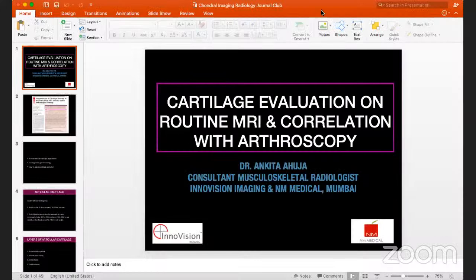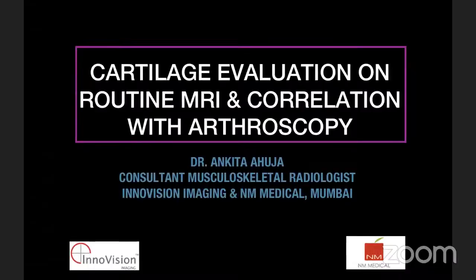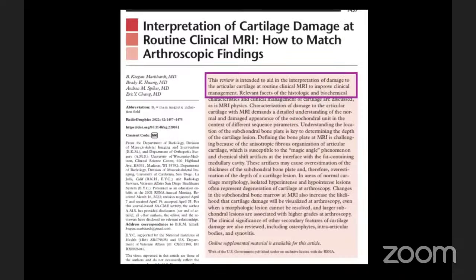Thank you so much for the invitation and kind introduction. It's a pleasure to be here. As already highlighted, what we are going to do today is understand how to evaluate cartilage on MRI. This is the most recent article which depicts how to evaluate cartilage on MRI and its correlation with arthroscopic findings — how to report on MRI in a way that matches what is seen on arthroscopy.